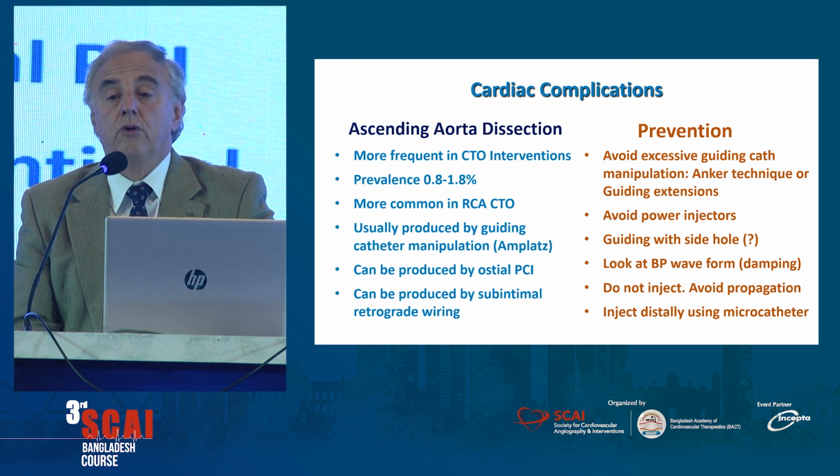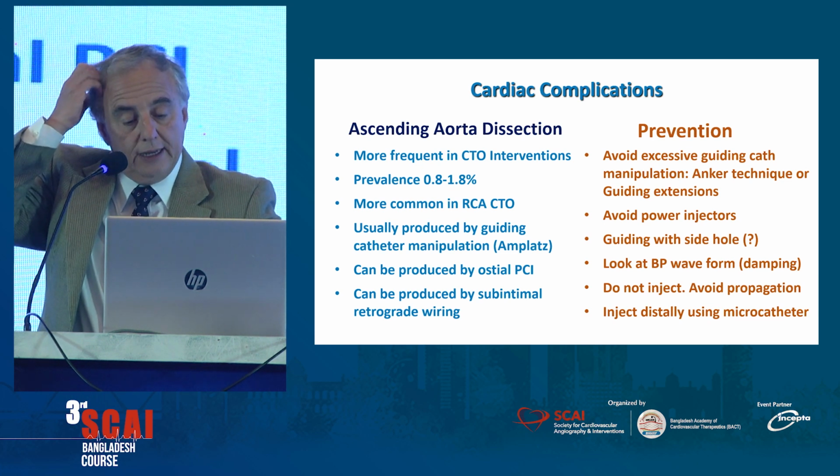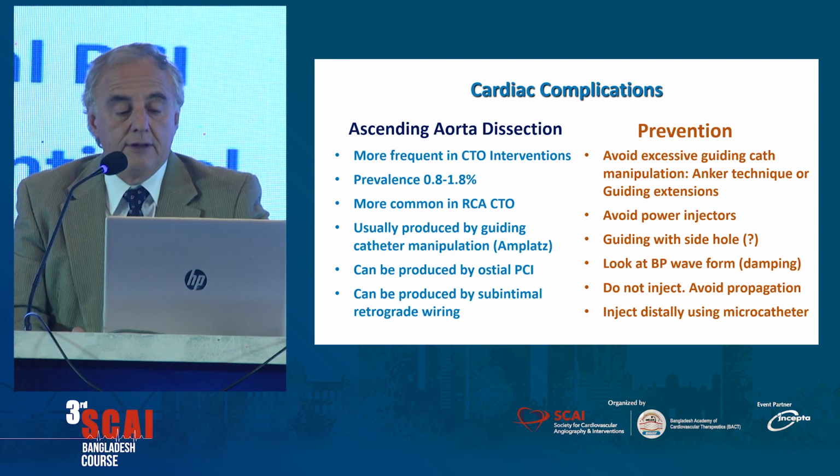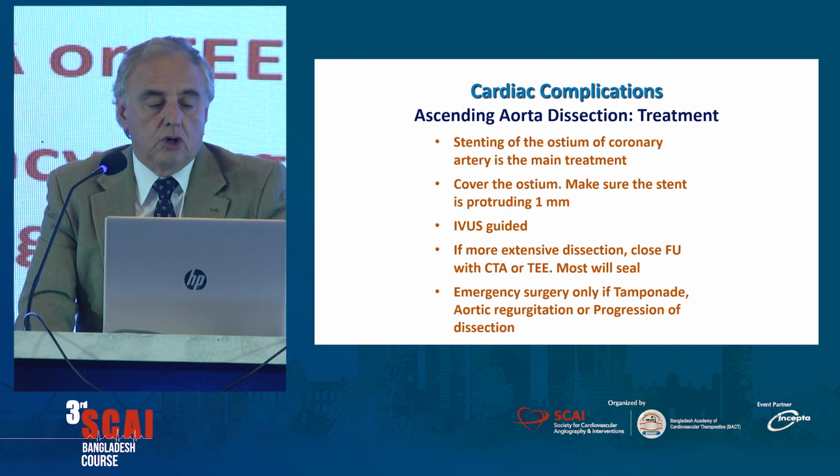Look at the blood pressure waveform. Very simple thing. If it's damping, it is a problem. Do not inject. Avoid propagation of the dissection. If you think that there is a dissection, do not inject, or inject distally using a microcatheter.